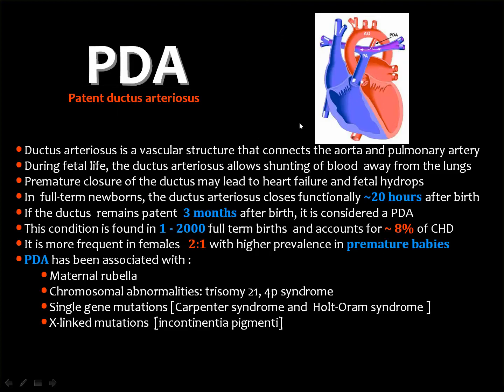Then we start the evaluation by the patent ductus arteriosus. The ductus arteriosus, as I have mentioned, is a small canal that connects the aorta to the pulmonary artery during the fetal life.